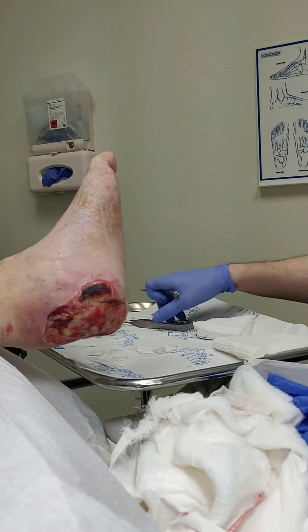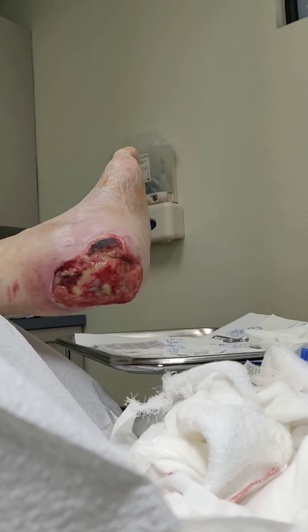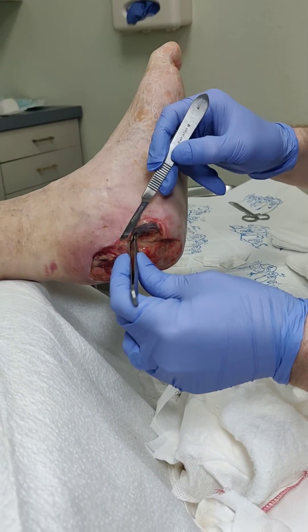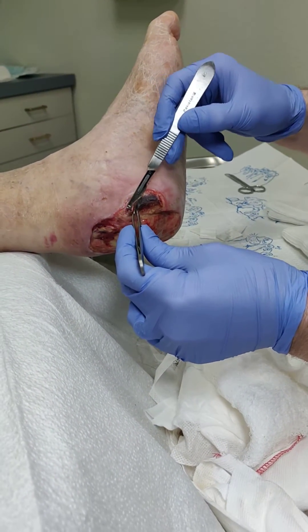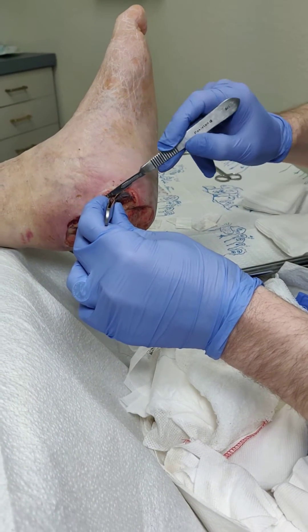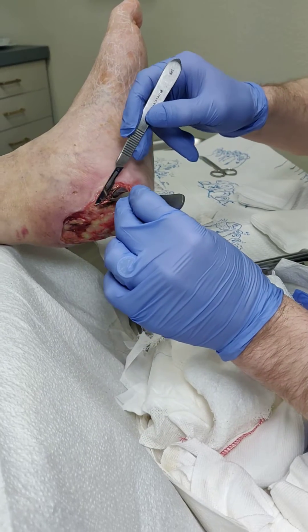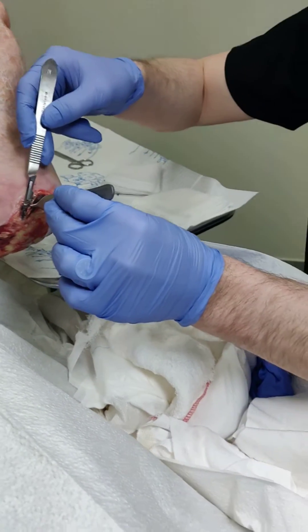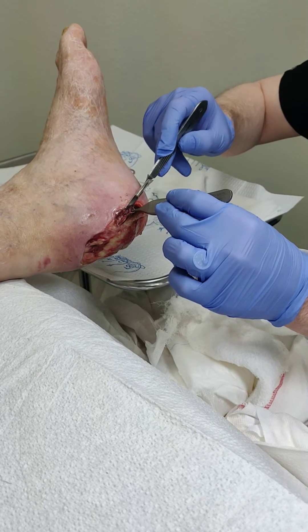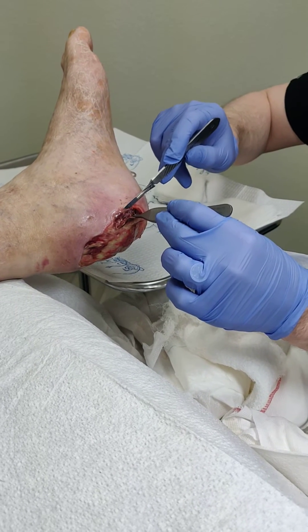We have a chronic full thickness ulcer here in the posterior heel. This was brought about due to a pilon fracture, and while the patient was healing from that pilon fracture, a pressure ulcer arose because he can't quite feel the back of his heel sufficiently. The dead tissue has been removed in the operating room, and now we're trying to accelerate healing.